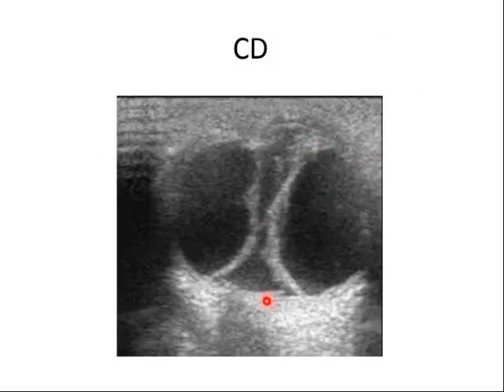This is choroidal detachment, and this sign is called the kissing sign, when the two membranes are somewhat attached to each other. This is the choroidal detachment, posteriorly not attached to the optic disc. This is the area of the optic nerve, and here is the area of the optic disc. Anteriorly it may extend more anterior to the ora serrata.